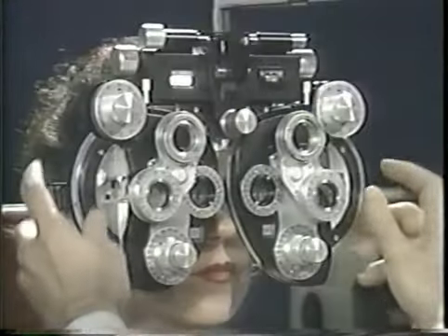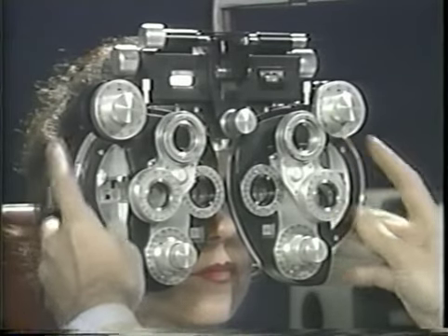Once binocular balancing has been completed, the patient should be perfectly focused at the distance of your visual acuity chart. If your chart is at 4 meters, you can dial 1 click up on both sides to move the patient's far points from 4 meters to infinity. I do this for hyperopes who are used to seeing absolutely clearly in the distance, but I usually leave myopes focused at the end of the room. If your visual acuity chart is at 20 feet or 6 meters, dialing a quarter diopter up on the phoropter will place the patient's far point only a 1/12th diopter beyond infinity.